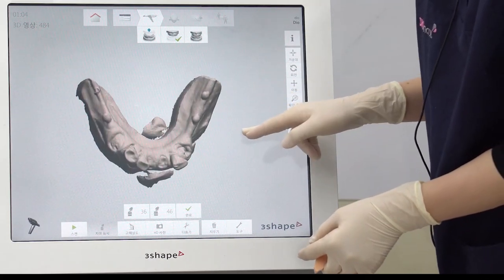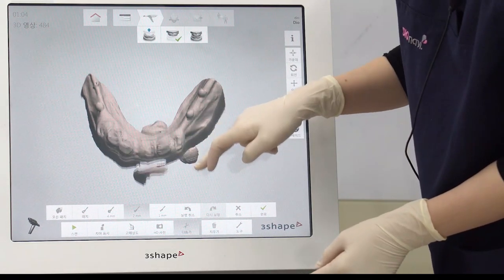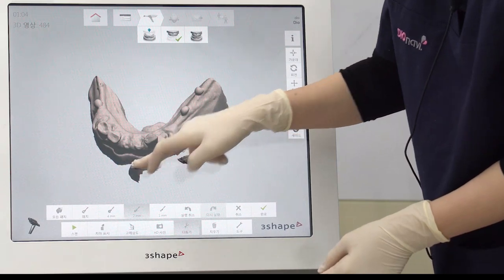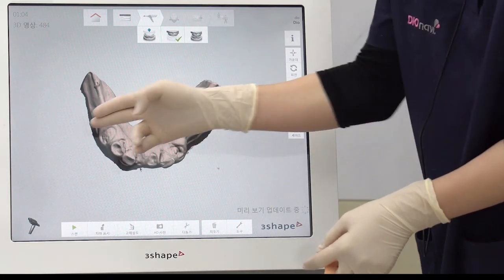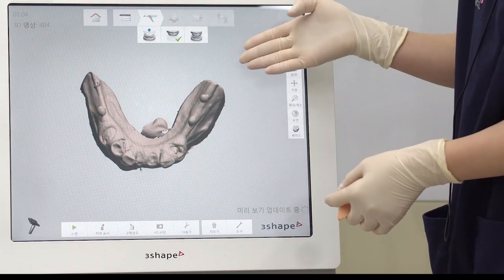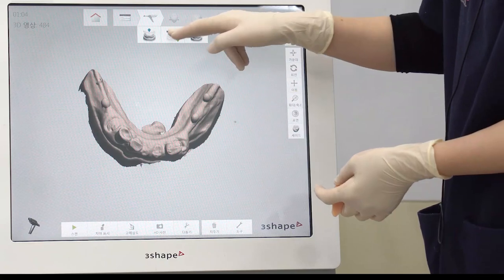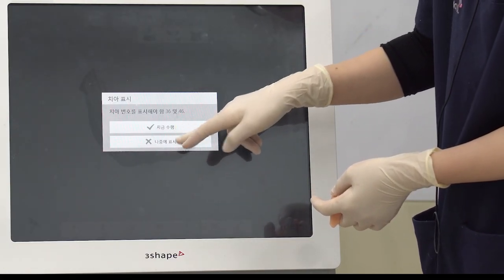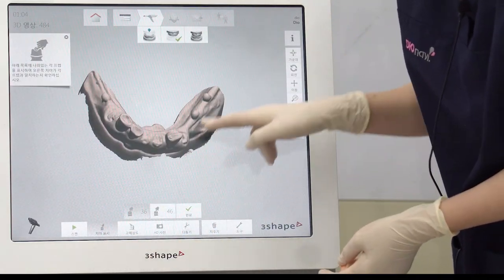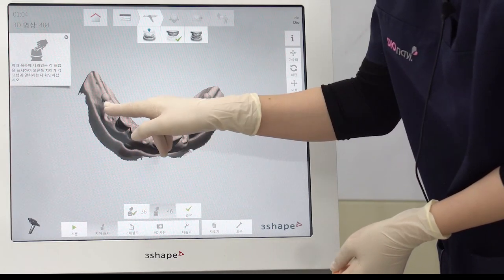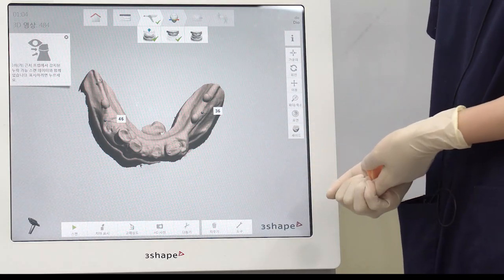If scanning is completed, click on the trimming button to delete unnecessary areas. If there are no teeth in the posterior area, make sure to scan all the way to the end of the gum line. After you finish scanning, mark the area where the implant may be placed. Click on the finish button to complete the scanning process.